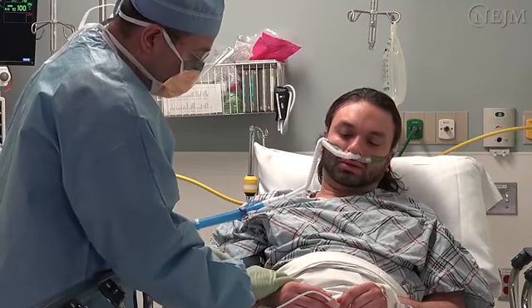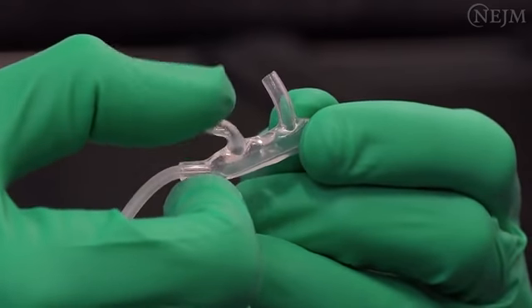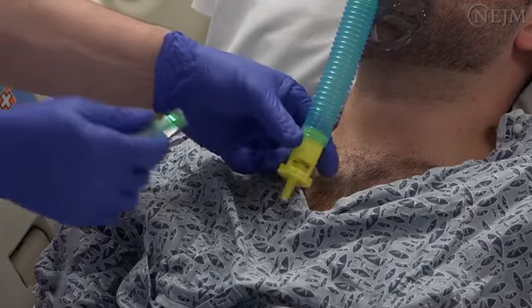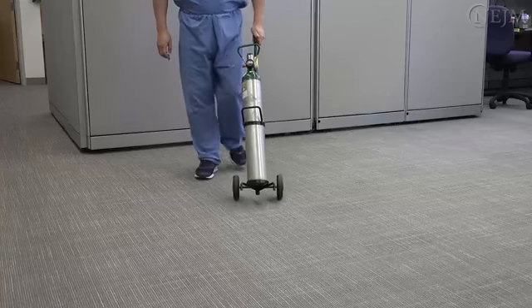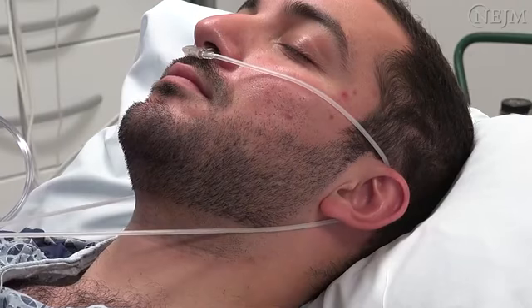Supplemental oxygen is an important therapy for a broad range of clinical conditions. Oxygen can be administered through low-flow and high-flow devices that deliver a range of gas mixtures, with or without temperature and humidity control. It is important for clinicians to understand the functions and properties of the various devices used for oxygen delivery to ensure appropriate treatment and to avoid complications.